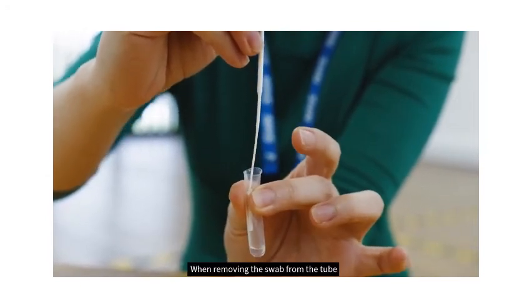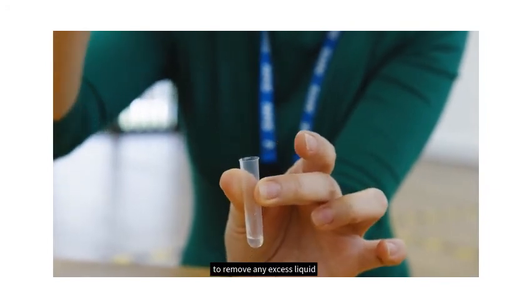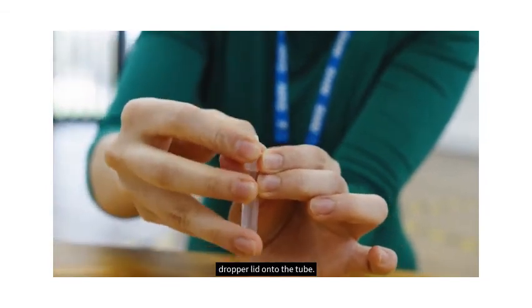When removing the swab from the tube, squeeze the flexible sides of the vial to remove any excess liquid. Put the used swab back into the packet it came in. Replace the dropper lid onto the tube.